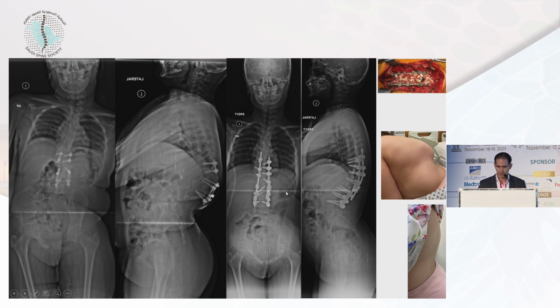And so it enabled achieving a satisfactory coronal and also sagittal alignment, even if the thoracolumbar kyphosis remained relatively high, relatively speaking, but given how the deformity was initially, it enabled her to have a more normal morphotype and normal walking.